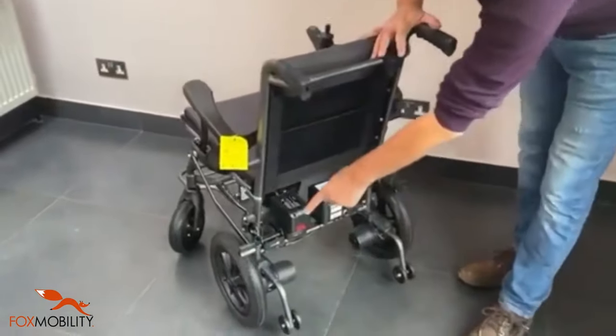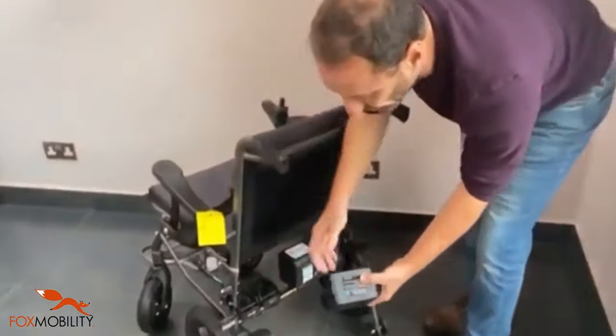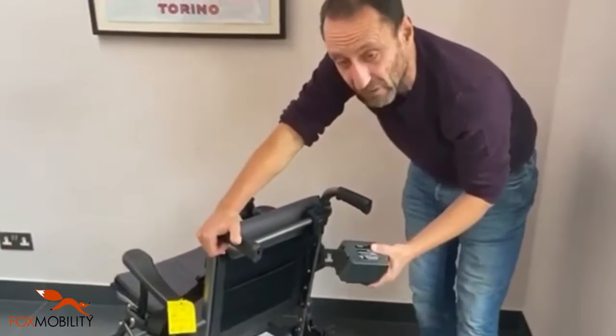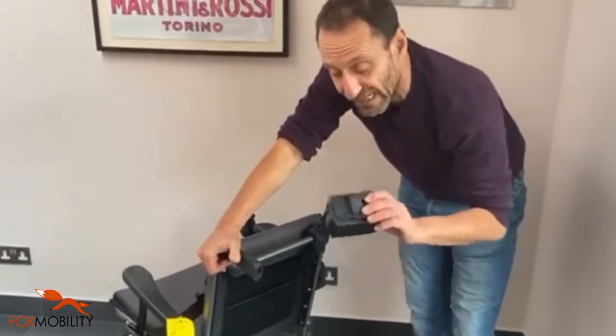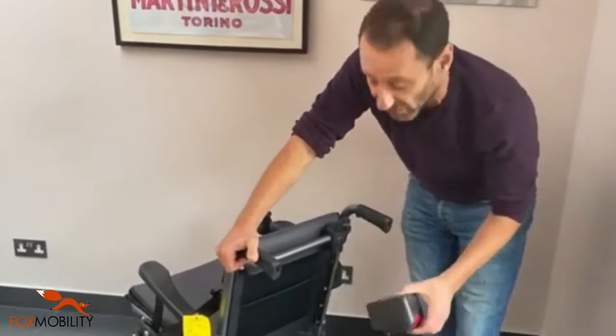At the rear you've got two 300 watt motors. You've got a nice battery configuration — 20 kilometres total range. Each of the batteries will do 10, but you can drive it with just one, so put one on and keep one charging.